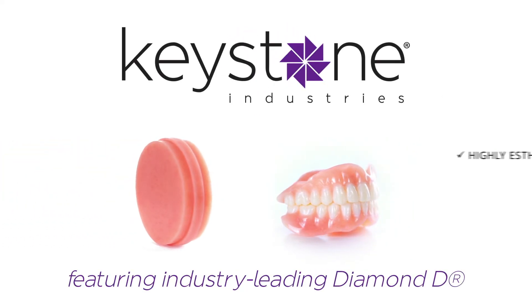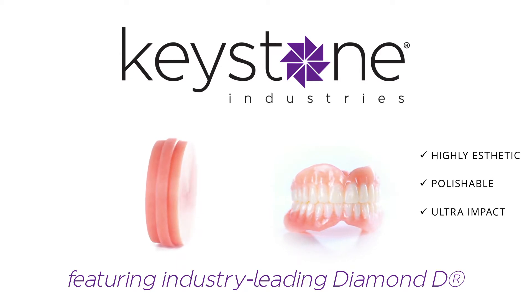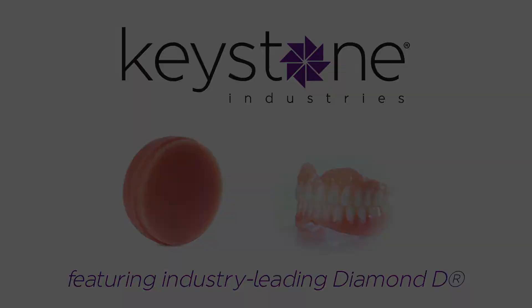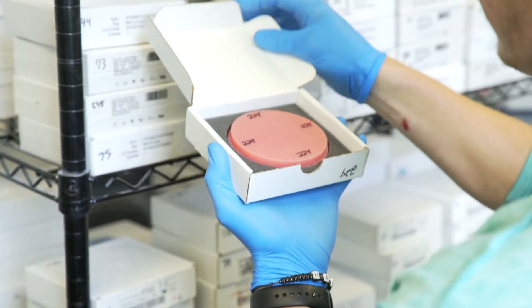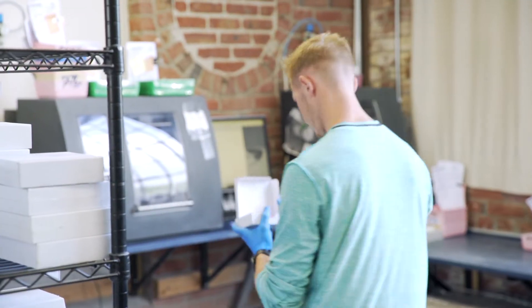Utilizing Keystone Industries Diamond D, our Key Mill Denture Base Disc is the new standard for creating comfortable, natural and easy to produce dentures. Each Key Mill Denture Base Disc comes ready to mill. This process saves time and keeps you efficient with no need for molds or mixing acrylics.